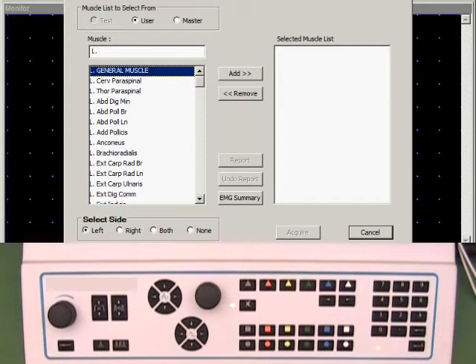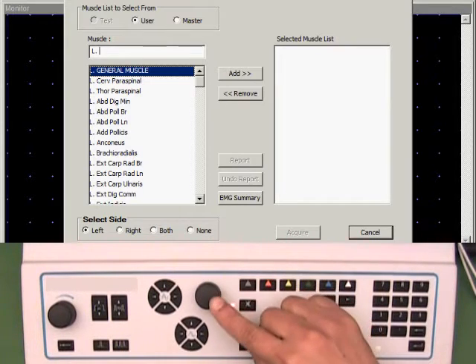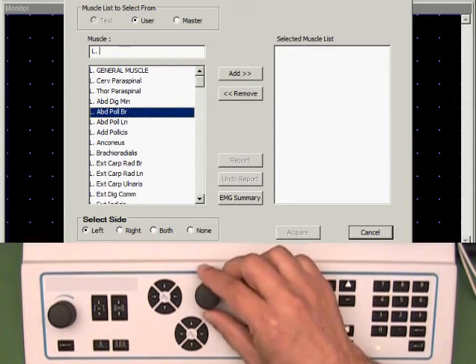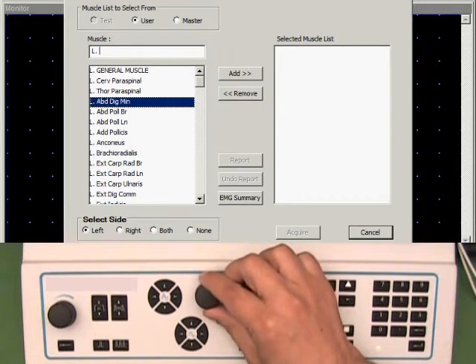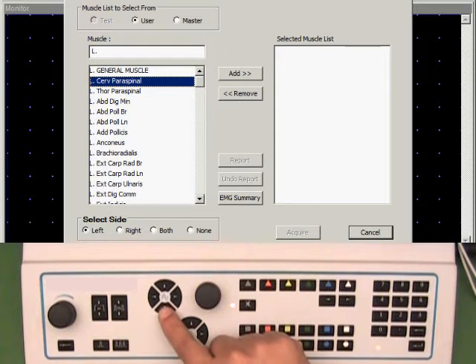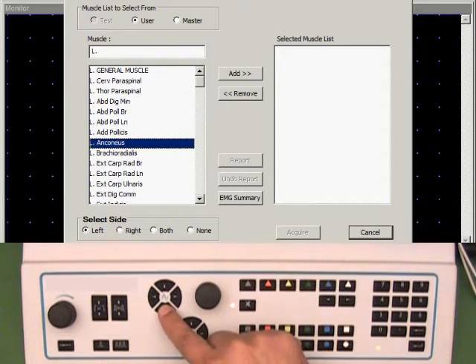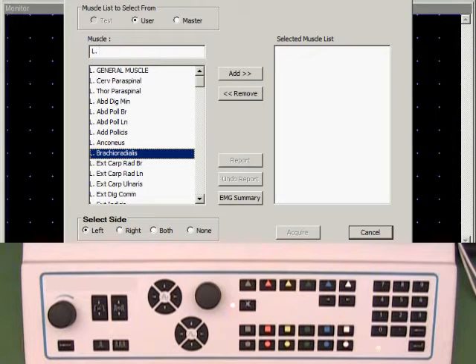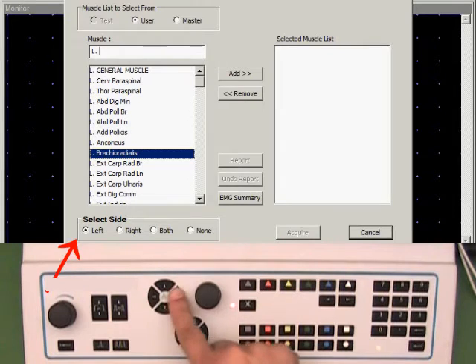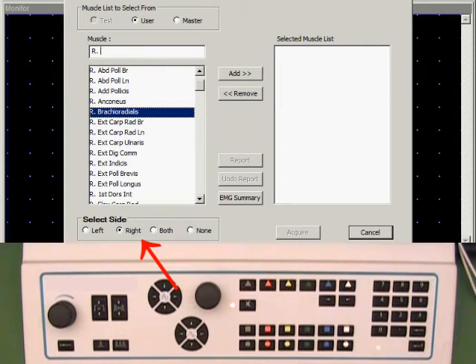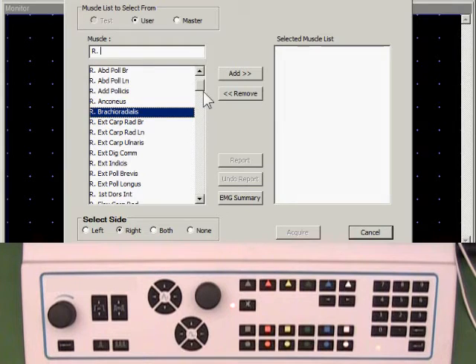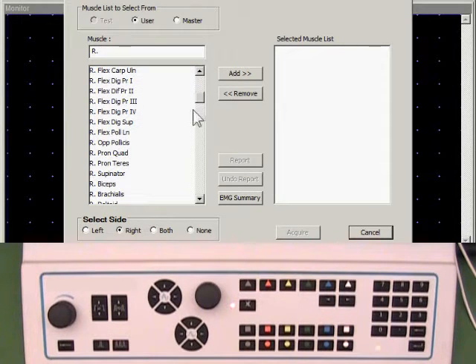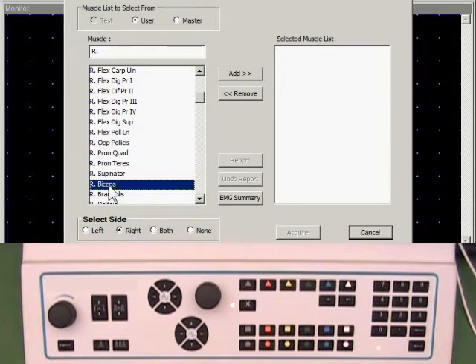A list of muscles is displayed. The general muscle is at the top. One can select the tested muscles in many different ways. We can use the select knob to highlight the desired muscle. We can use the up and down arrow keys to select the desired muscle. We can select the tested side by using the left or right arrow keys. We can also use the mouse to select the muscle. In this case I'm going to test the biceps muscle. I will double click on it.